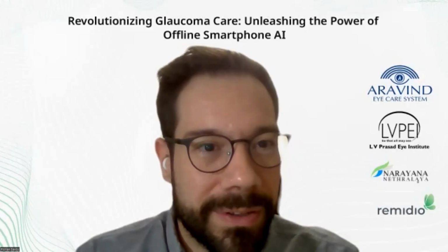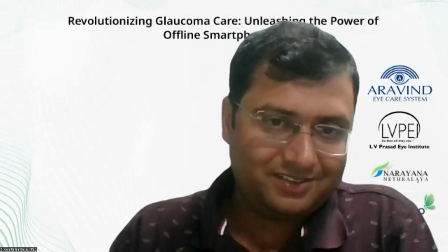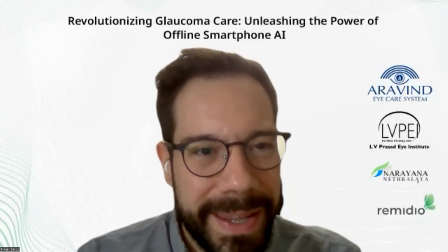So in the case of glaucoma, we already have a neural network that just crops the disc, which means the AI doesn't need to learn to only look at the disc because it's only being presented with the disc. And then there's another model that does VCDR. So the range that the AI needs to learn is a bit smaller, so you can do away with fewer images. But it's really problem specific and pretty hard to predict upfront. At the end of the day, it's a trial and error process.